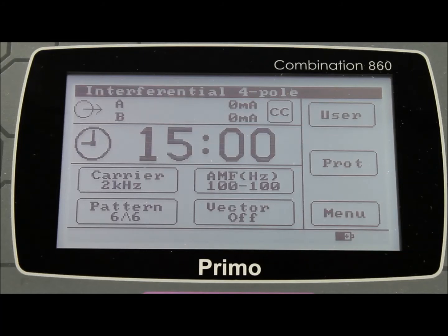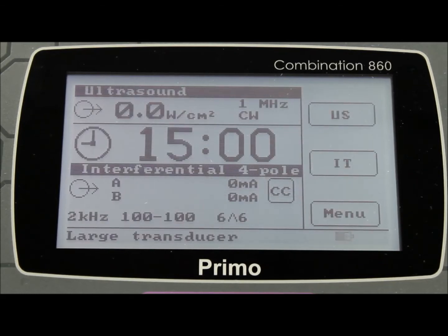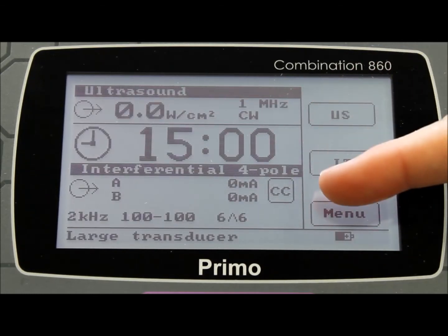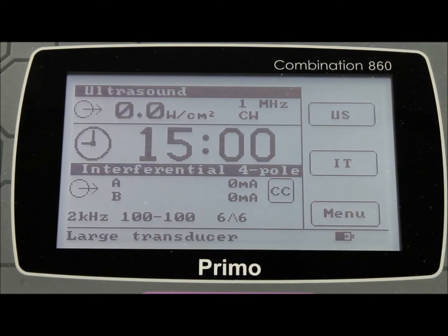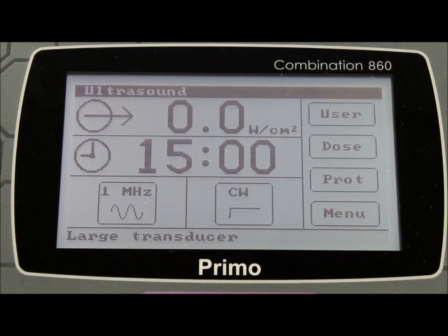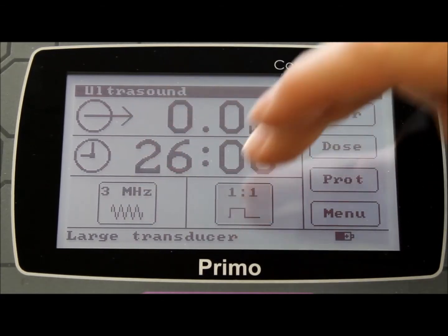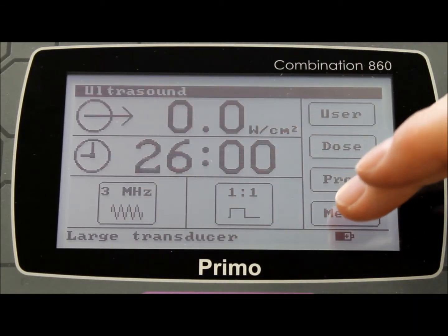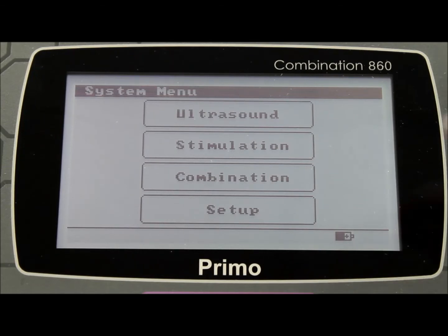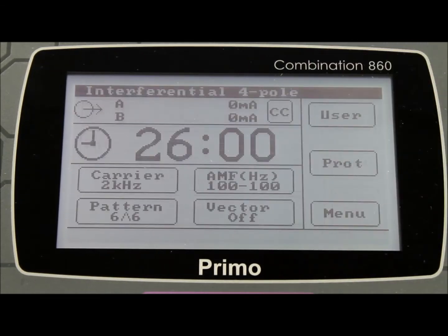The unit can be used in combination mode, offering the benefits of ultrasound therapy and stimulation therapy at the same time to the same patient. In order to set the machine up for combination therapy, you will need to select the individual modalities first. From the ultrasound menu, make the selection of time, frequency and pulse mode and then return to the main menu. From the stimulation menu, choose the type of stimulation, for instance 4 pole interferential, and you can then choose the same time along with the carrier frequency.